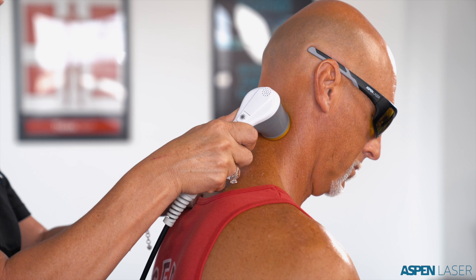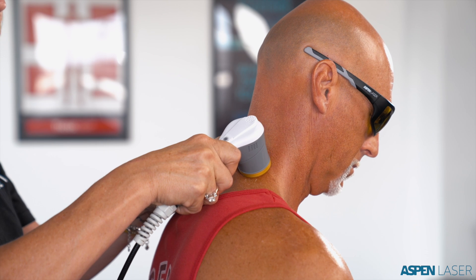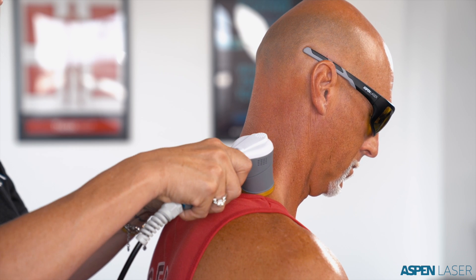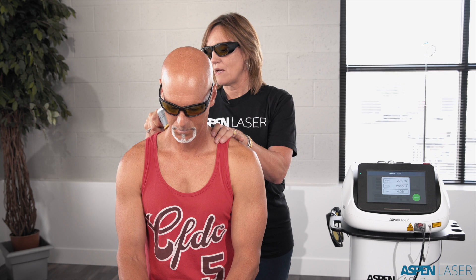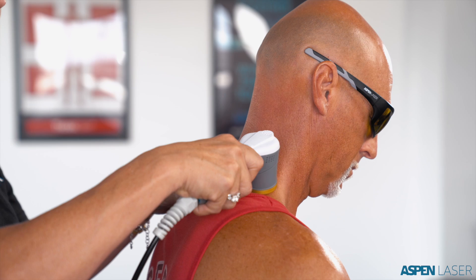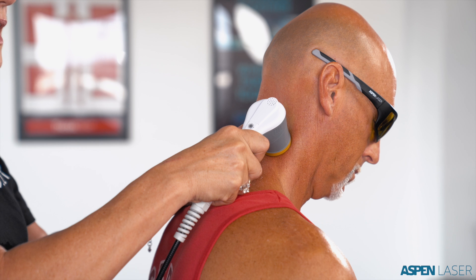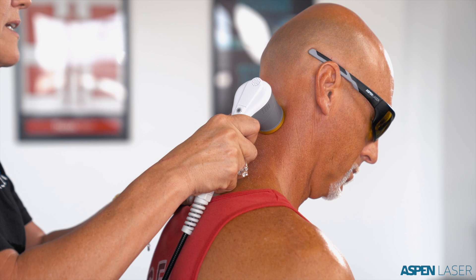Now I start to use firm pressure and a gentle sliding motion in either a two-by-seven or a three-by-five treatment area — I choose one based on the anatomical location of the pain. I will treat in two-and-a-half-minute increments and then retest both the pain and the range of motion. If my pain scale was higher than five to start, I might go to five minutes before retesting. He's a healthy individual, so I typically start at two and a half minutes. I tell the client this should feel warm but never uncomfortable — it should feel like sunshine — and then I ask if they have any questions.